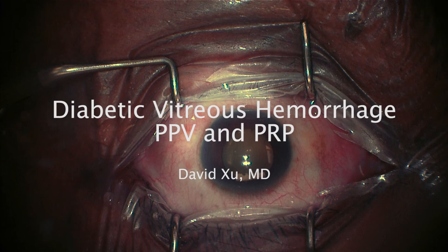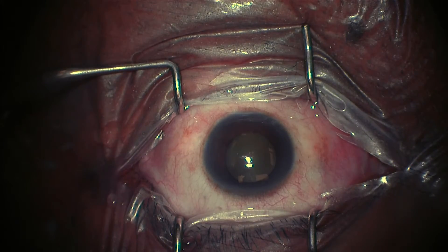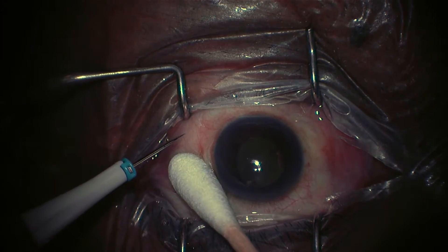Hi everyone, this is David Chu, and we're going to talk about a diabetic vitreous hemorrhage treatment using pars plana vitrectomy and panretinal photocoagulation. We're going to take this from the top, the same as before.